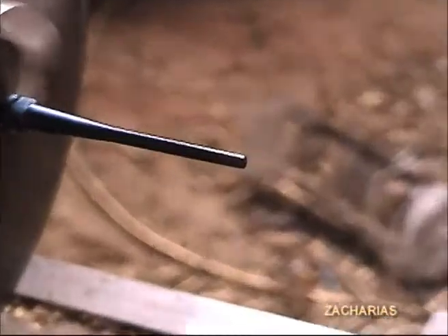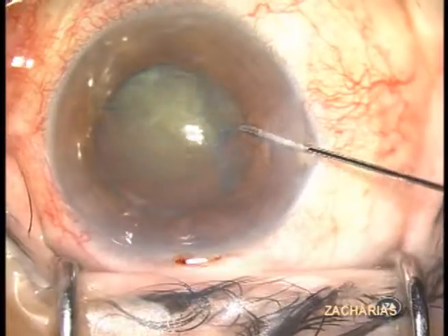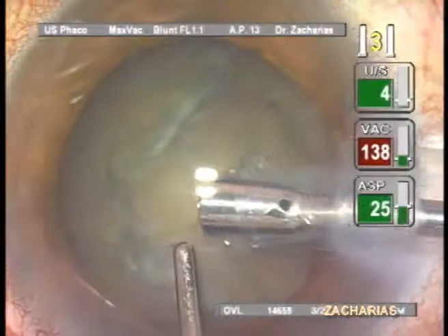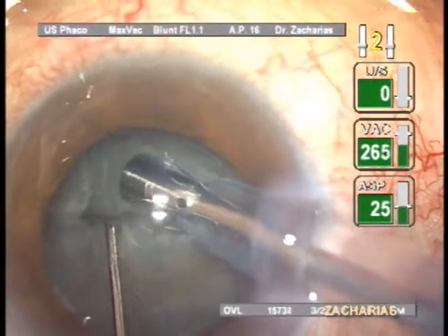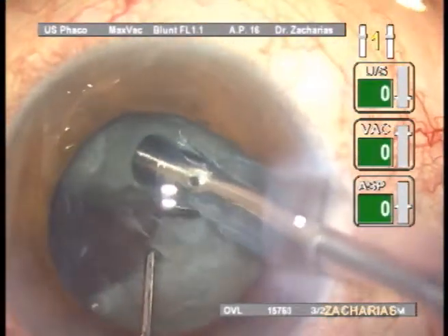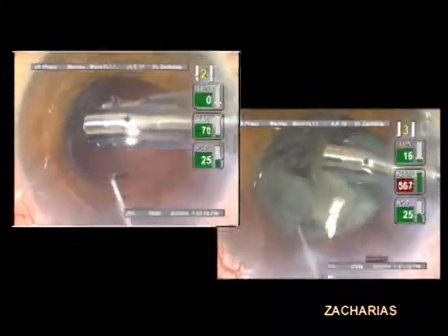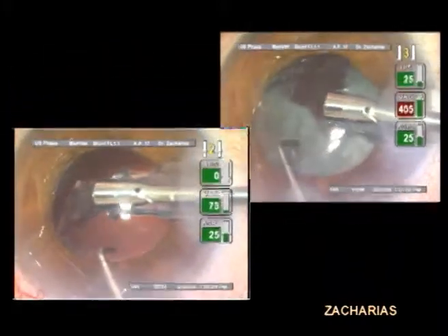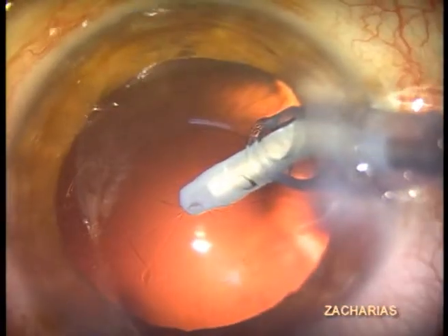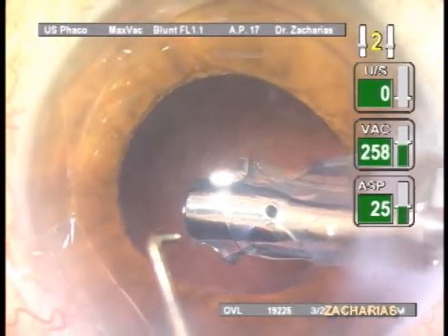We constructed a surgical-grade soft-tipped phaco probe prototype and performed real surgery in a few human subjects. The typical surgical steps of sculpting the nucleus and performing phaco chop were completed adequately even in relatively dense cataracts. Furthermore, the soft phaco tip was efficient to remove the epinucleus and the residual cortex safely without the fear of a capsule rupture. With the background data on capsule safety of elastomer-covered IA handpieces, we were confident to aspirate residual fibers from the posterior capsule without any problem.